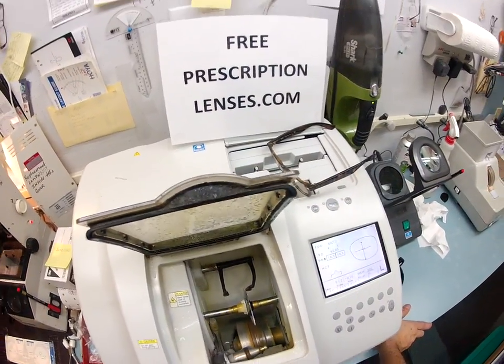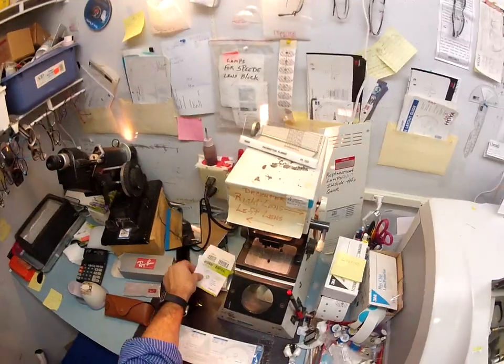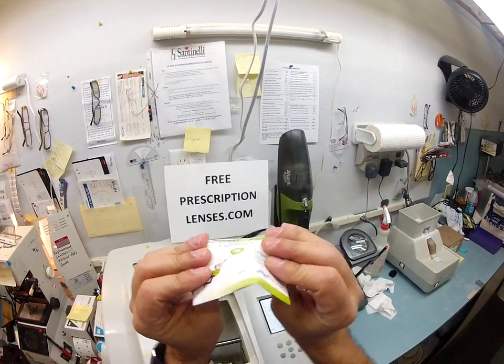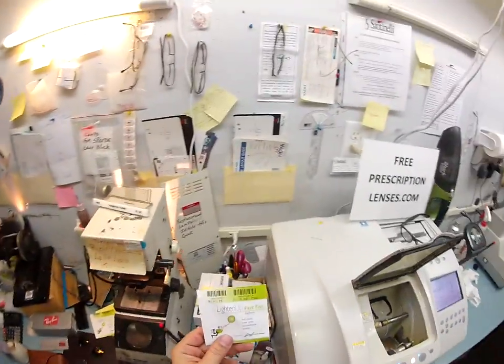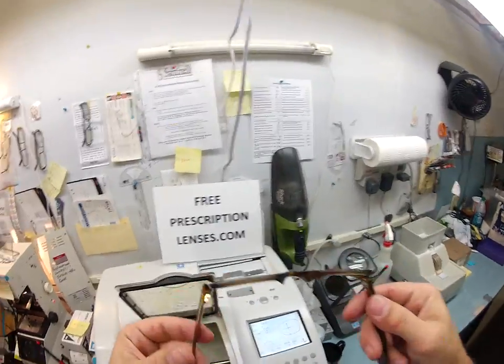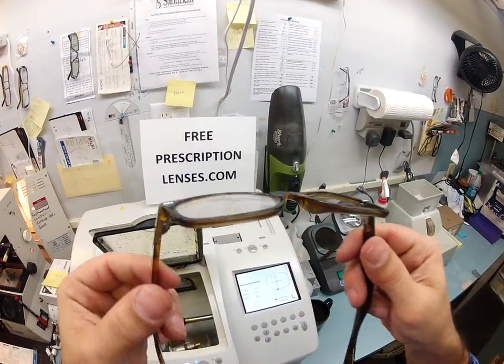If you notice, these lenses are very flat — they're aspheric lenses. A spherical lens is very round, it bulges, and gives you that fishbowl look like cheap lenses do. This is aspheric — it's very flat. Much better cosmetic appearance in the frame; it does not bulge outward.